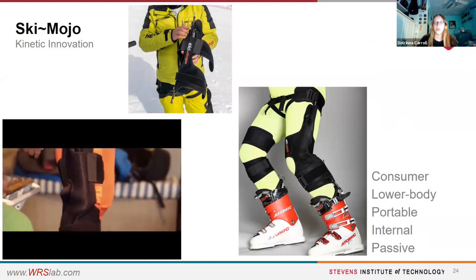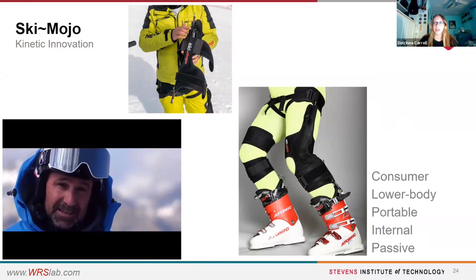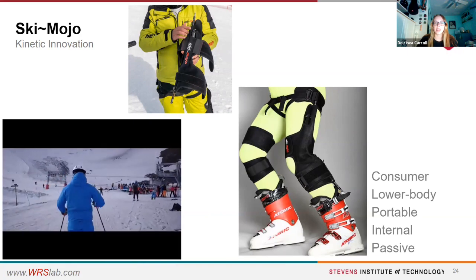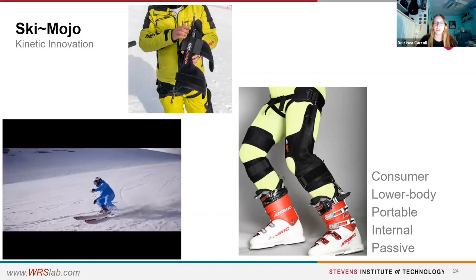It is portable with no fixed frame and has anchoring points on the wearer. This means that it is controlled by internal forces. The device has passive joints because it has no motors and uses a spring dampening system to absorb the pressure on the knees.